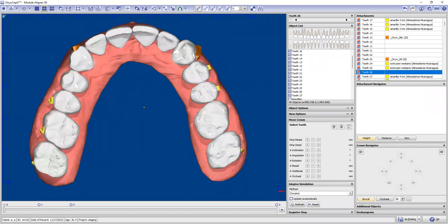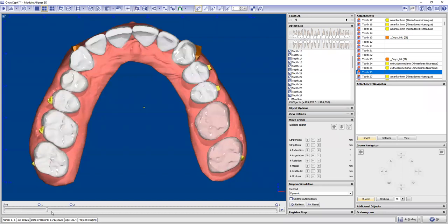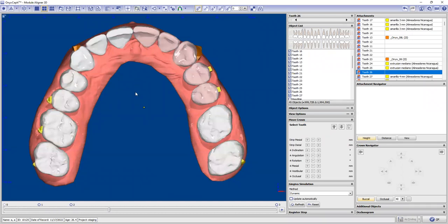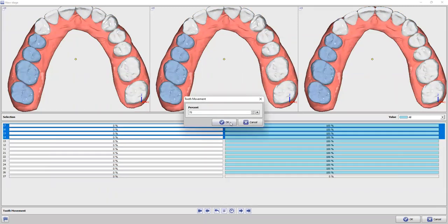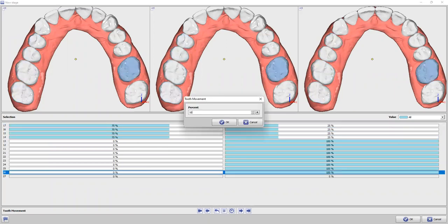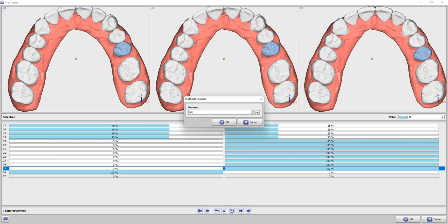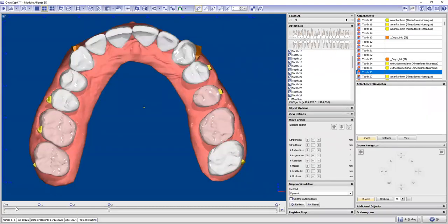Now you can see we have 25% of this tooth's movement and 50% on this side. On the second stage, you will have 50% of this movement, 50% of this one, and 100% of the second molar. You can see in the timeline it goes perfectly. So what you have to do next is the same thing until you finish your staging. We'll do it a little faster - select everything, click zero, tell this tooth to go 75%, tell this to go 100% since we already finished with the second molar, and tell this to go 50%.